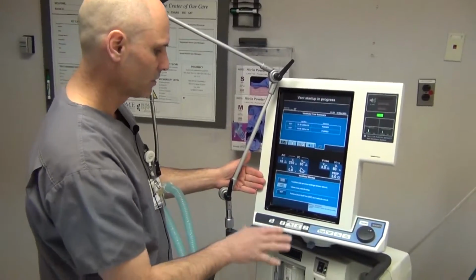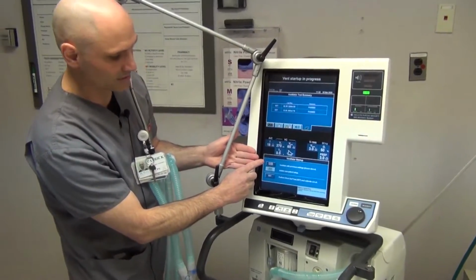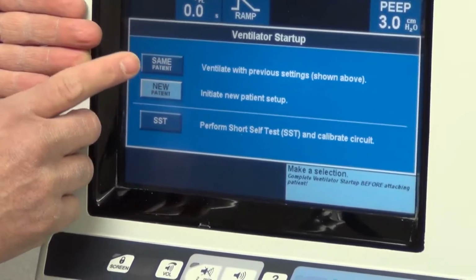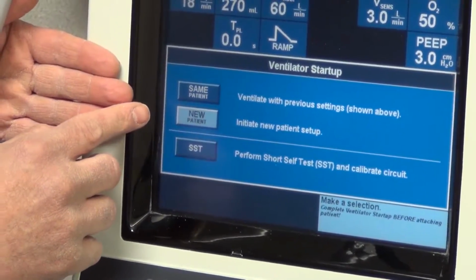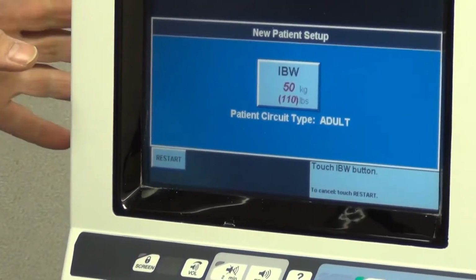between patients. You don't have to worry about that. The thing you have to worry about is, is this the same patient you've been ventilating? Have you been to CT and have come back? If that's so, you just sit same patient and continue on with the instructions. For our purposes, we're going to say this is a new patient. We're going to hit new patient.